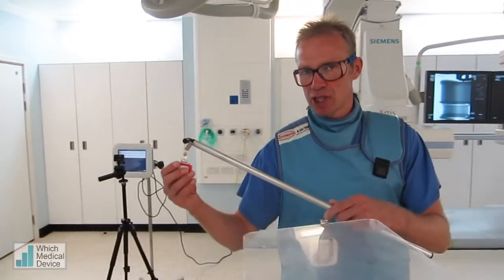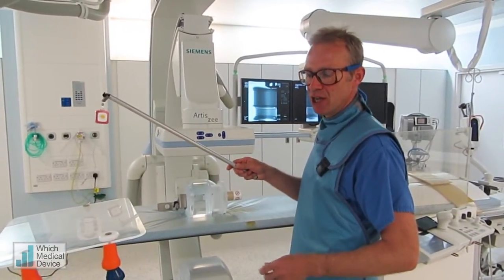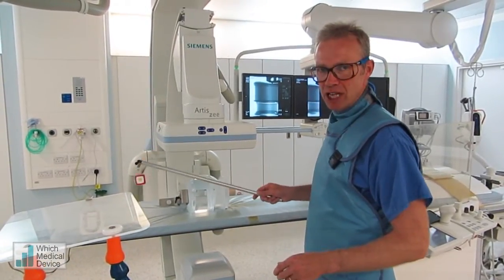I've connected one of the badges onto this pole, and I'm going to be positioning this in various places around the image intensifier. We've got another badge here which is in a fixed position, and I'd just like to show you what happens to the dose depending on where you're standing.